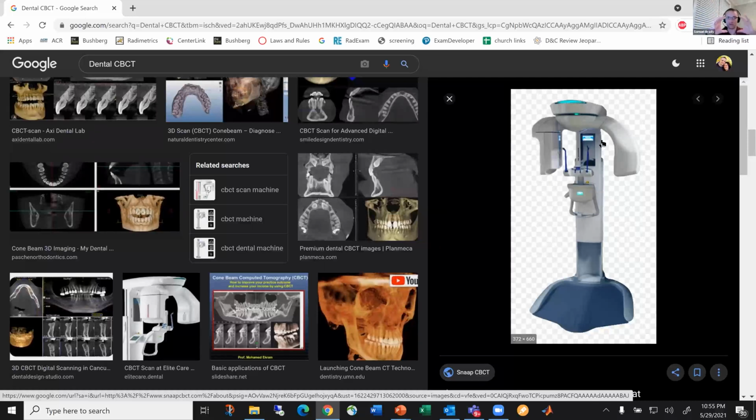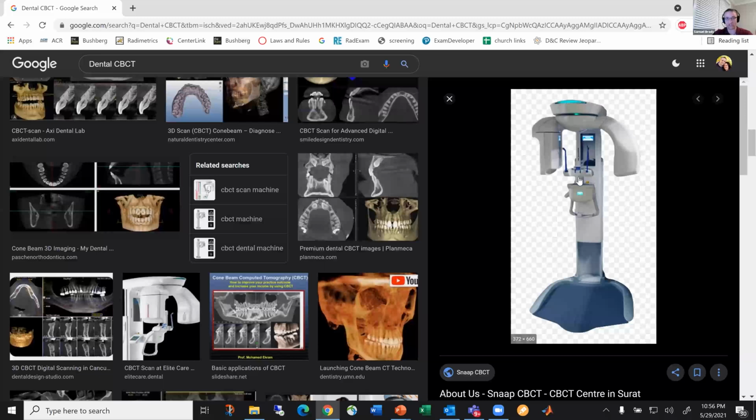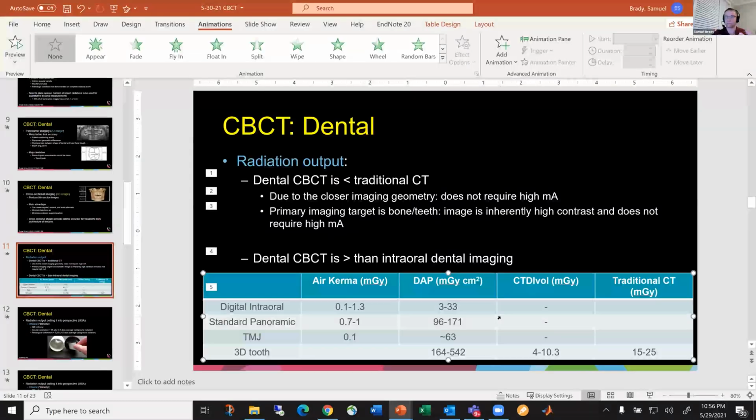If you put it in a real traditional CT scanner, because it can go all the way around, the left and right numbers are almost always the same. So when you do the CTDI calculations in these machines, you have to be very careful how you set up the phantom and where you put your ion chamber to make all your measurements. That said, it's the same calculation. When these numbers, this 4 and this 10, I actually physically measured using my phantom, my 100 millimeter or 10 centimeter ion chamber. I did the rotation, I did all my averages, and I still did the same calculations.